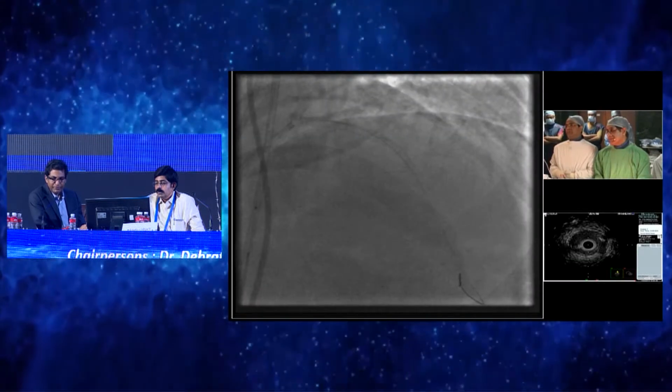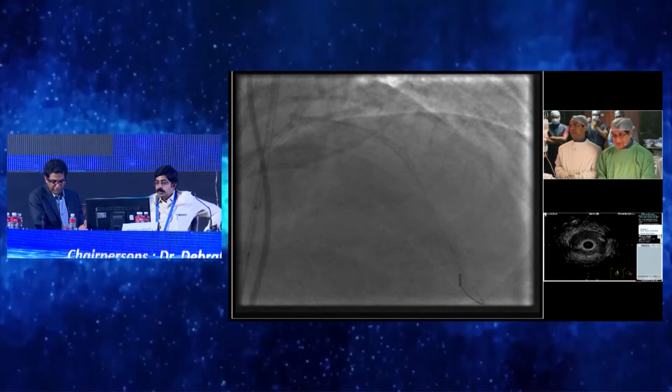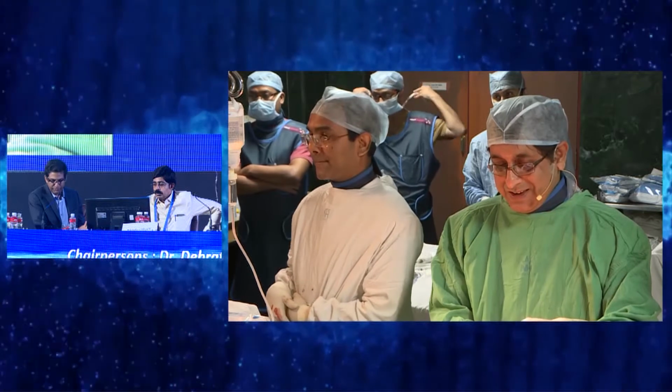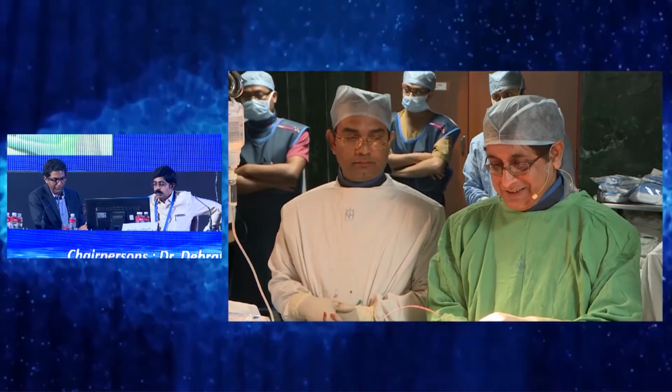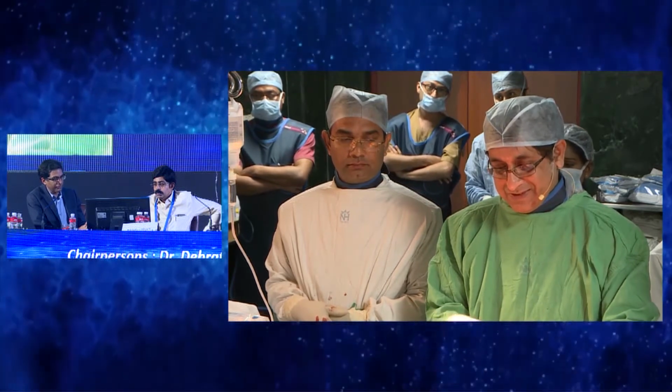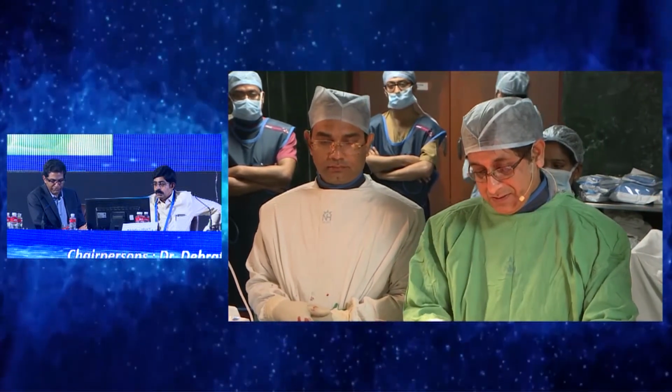So thank you very much. I really appreciate you, Dr. Bhattacharya, and your team for showing this fantastic CTO, which you made look very simple by using a microcatheter and a wire. And I really congratulate your team for such a good procedure done safely.